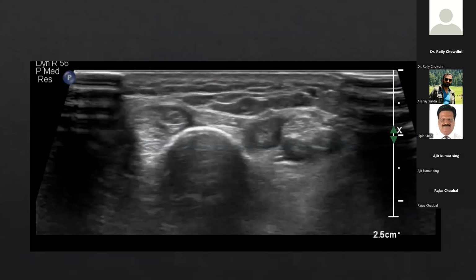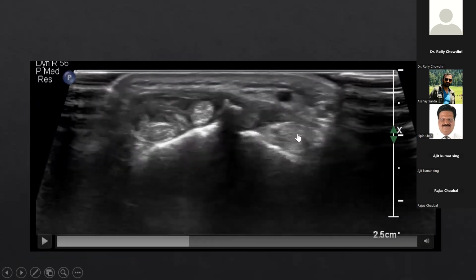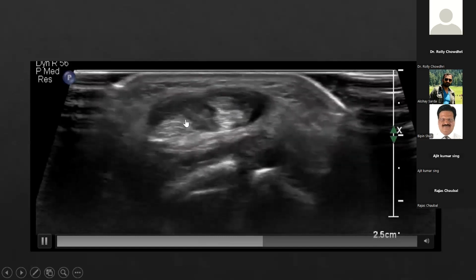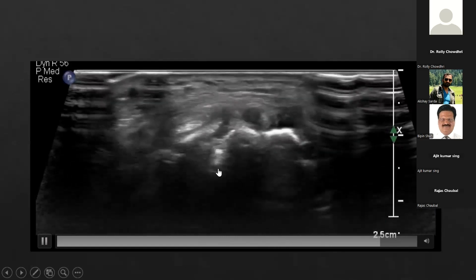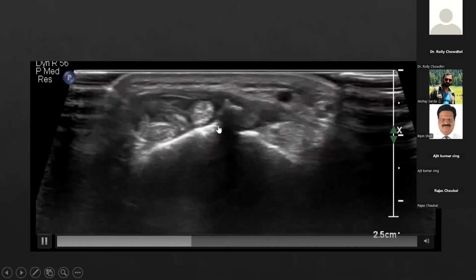Now coming to one more pathology, where we have pain a little more on the dorsal side, close to the thumb. As you can see, we'll go here. This is your extensor digitorum, that is the fourth compartment. This is the extensor pollicis longus, at Lister's tubercle. As we see the extensor pollicis longus crossing over the second compartment tendons, there is significant thickening around the tendon. There is fluid, and thickening of the extensor carpi radialis longus as well as brevis.